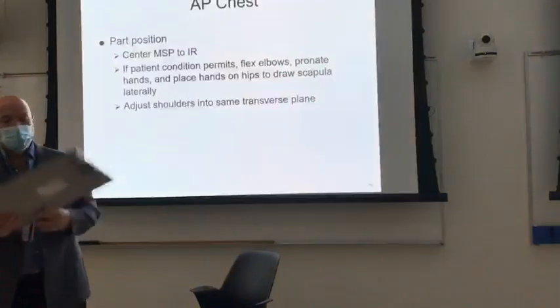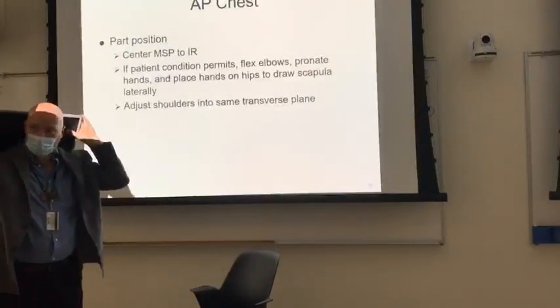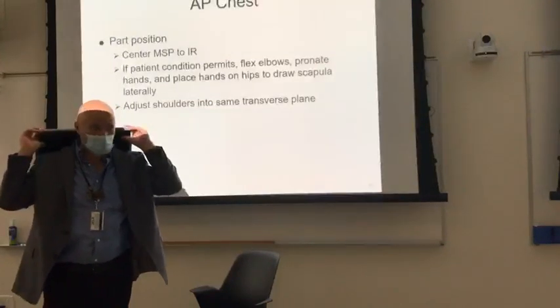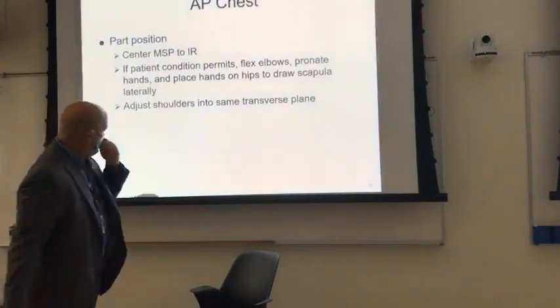And what you're gonna do is you're gonna put the image receptor behind the patient's back. So the top of the image receptor is gonna be where? An inch and a half above the outer portion of the shoulders, right?